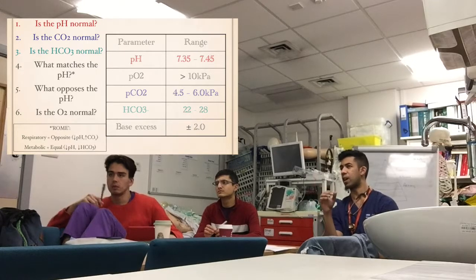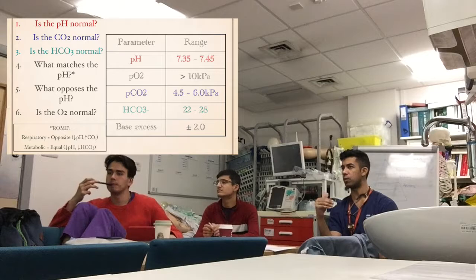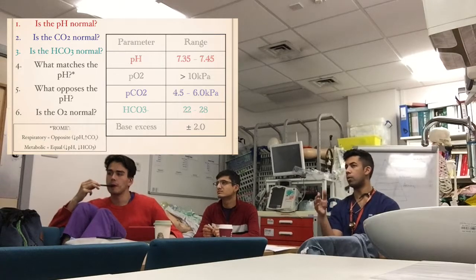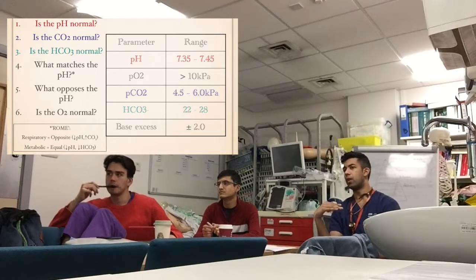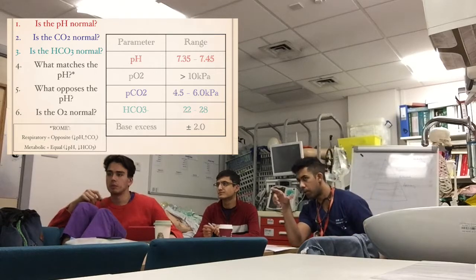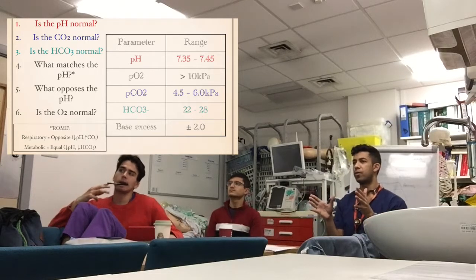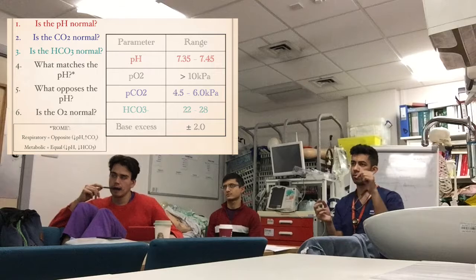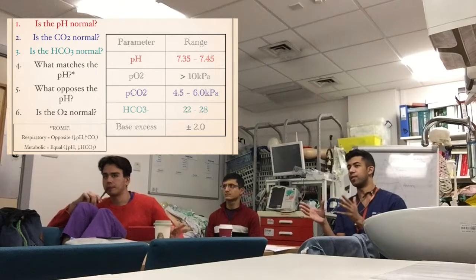So if you have an acidotic pH, i.e. a pH less than 7.35, what's correlating with that? Have you got a high carbon dioxide, which is respiratory acidosis, or a low bicarb, which tells you it's a metabolic acidosis? Does that make sense? Once you've noticed what matches it, you look at what opposes it: what opposes the pH and what matches the pH. If you look at the bottom left, I've got a mnemonic there, ROME. Imagine looking purely at numbers: if you've got a pH that's down, like 7.2, it's a lower number than 7.35, isn't it? Basic maths.